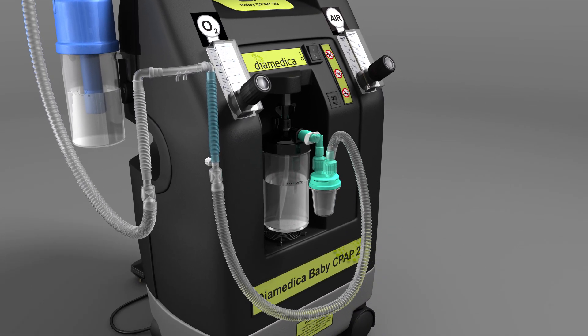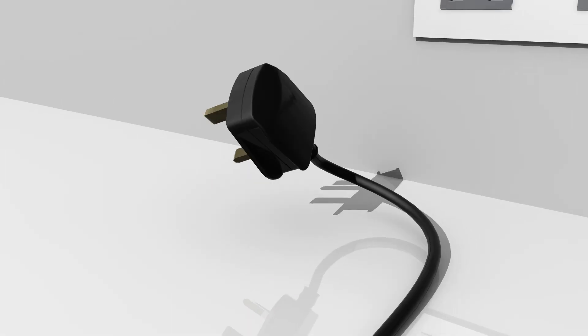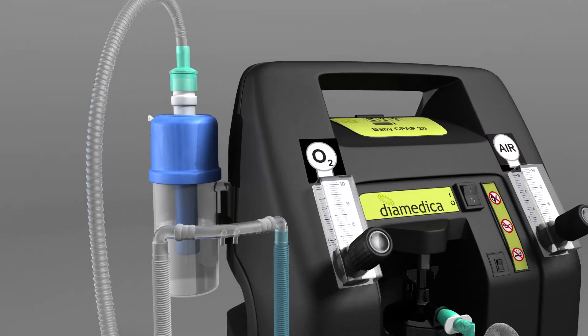Connect the inspiratory limb of the circuit to the humidifier bottle. Connect the expiratory limb of the circuit to the bubble bottle. Plug the power cord into the mains electricity supply and switch the CPAP on.